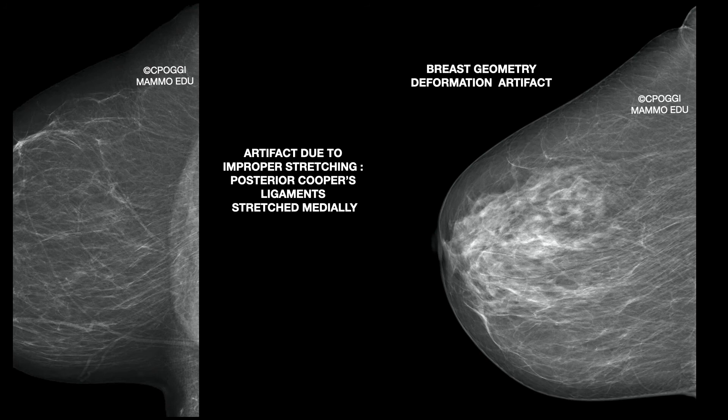The direction of the radiographer's hand moving out of the field should not produce artifacts. As you can see in the first example, the posterior ligaments of Cooper appear somehow stretched medially. The same occurs in the second example, associated with a fault in positioning technique as well.